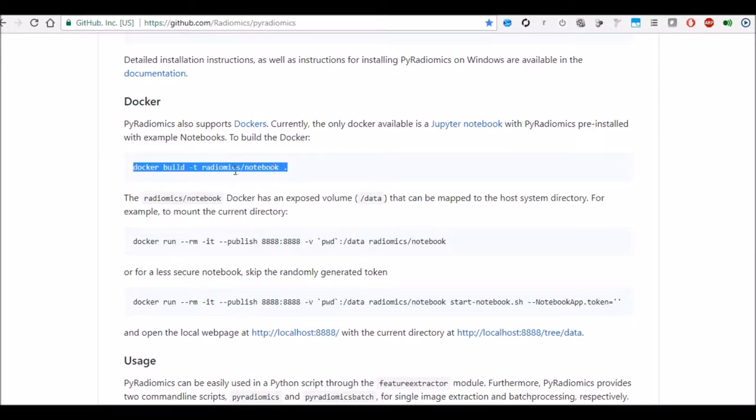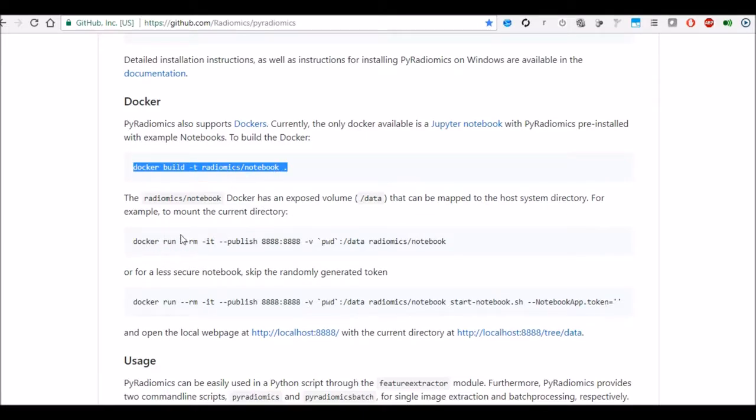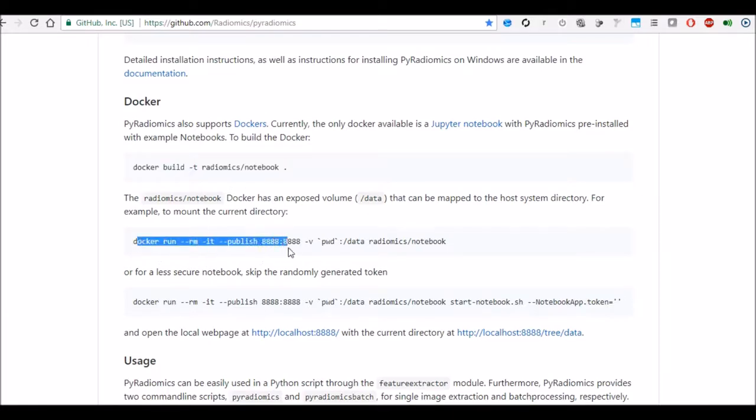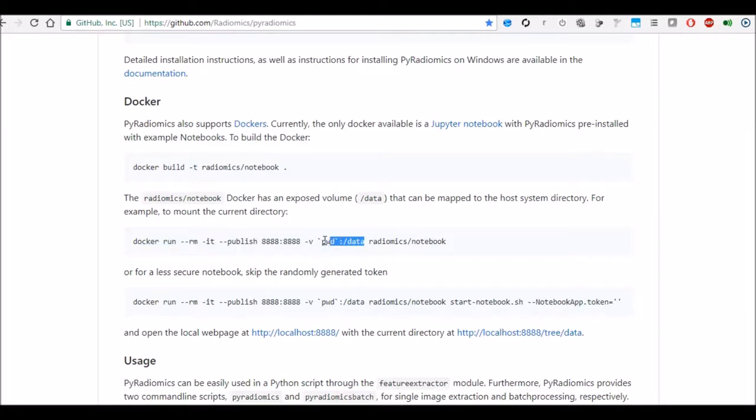Once the docker is installed then you can follow these instructions like docker build t radiomics notebook. So this is one of the notebooks which will be used with jupyter which will elaborate later on. And then once you have built the notebook then you can run it, basically you will publish it on your localhost 8888 port and provide it the volume where your data will be sitting and then finally ask it to run the notebook.